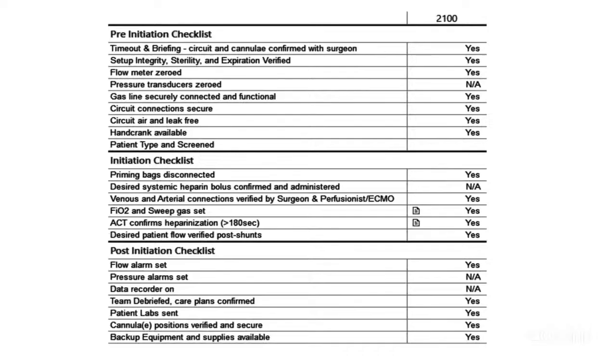So that is the crux of the whole topic. The most important thing, one more I wanted to tell, is that the more you prepare during peace, the less you bleed in war, as the old saying goes. So the more you prepare or push yourself during the training period, the less are the chances of having any complications, bleeding or anything during your preparation and initiation of ECMO. Thank you.